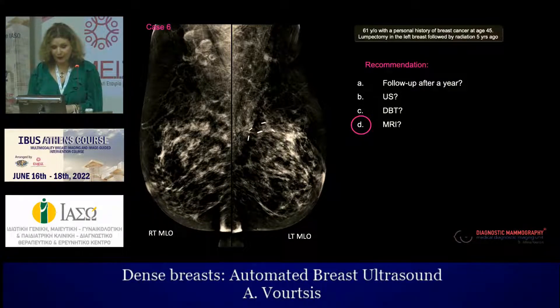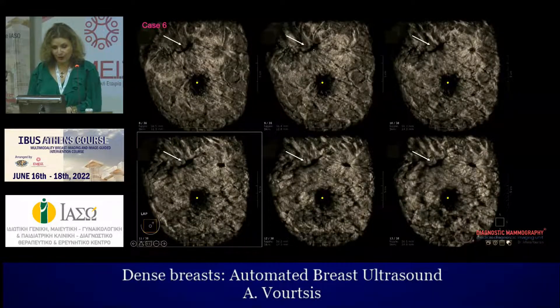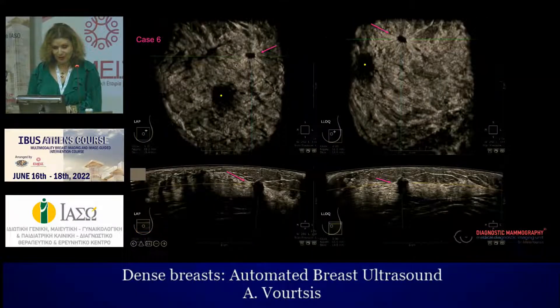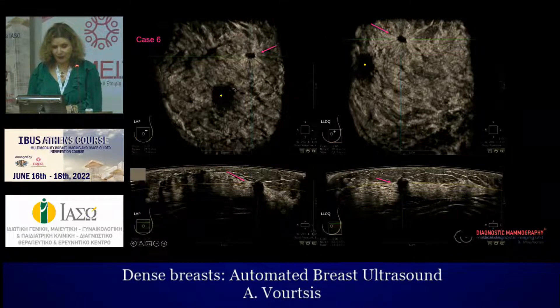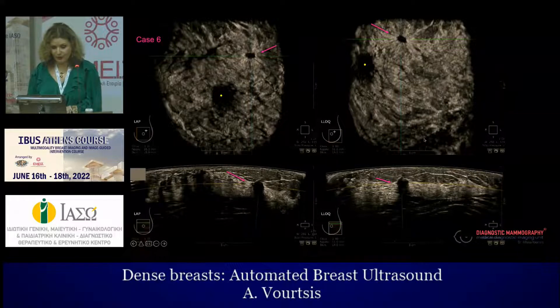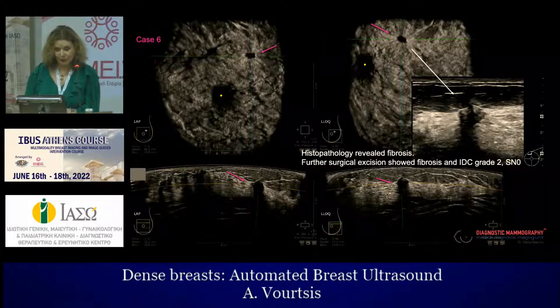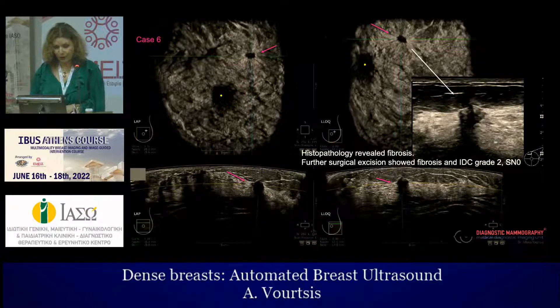We performed ABUS instead. In addition to the surgical scar, there is a speculated mass in the inner part of the same breast — not related to the post-operative changes. On the coronal and transverse planes of both the AP and oblique acquisitions, a suspicious mass with enhanced acoustic shadowing is visible. We performed core biopsy under ultrasound guidance, which showed fibrosis. However, further surgical excision was necessary, which showed fibrosis and invasive ductal cancer grade 2. The sentinel node was negative.